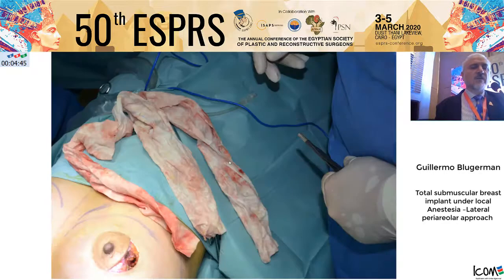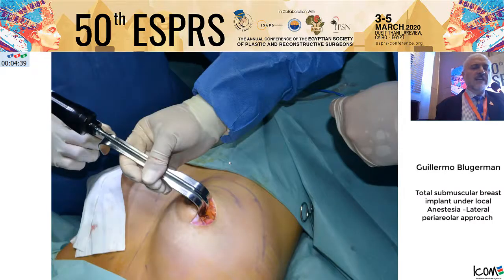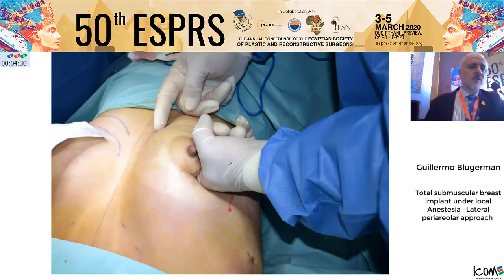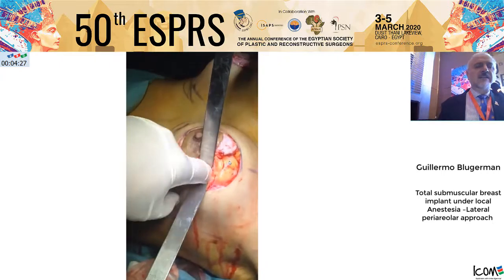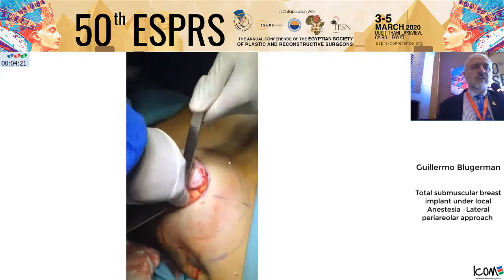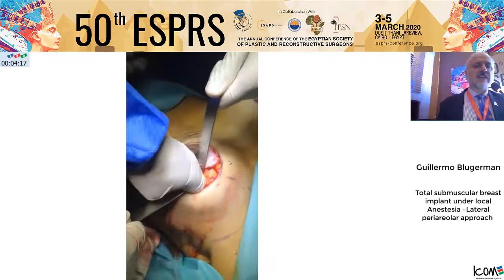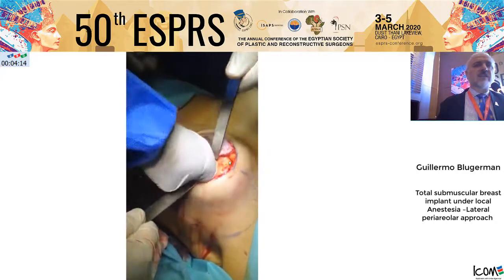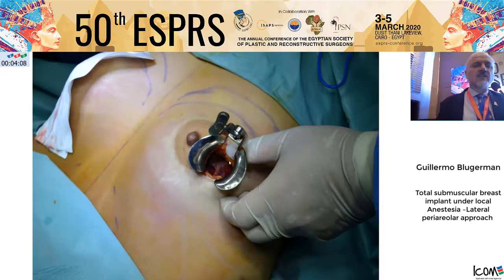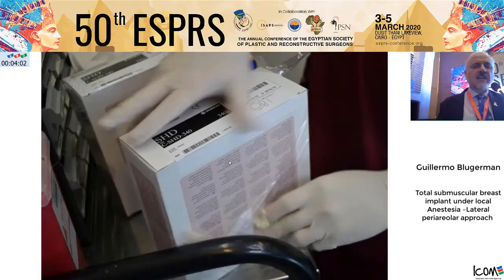When we return to this side, we remove the gauze and there is no bleeding in the area at all. We regularly check the pocket, and it is not necessary to use the cautery in 90% of cases. We recheck the pocket. To dilate the entrance, we put two fingers — if we can introduce two fingers in the tunnel, it is possible to introduce a 400 cc silicone implant. No traumatic dissection, no cutting. A gynecological instrument can also be used to dilate and check inside.